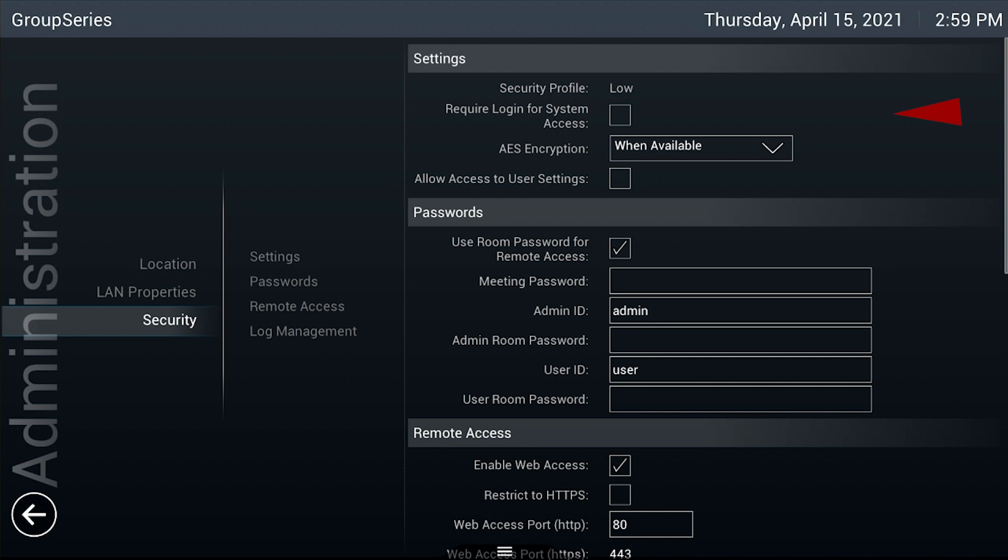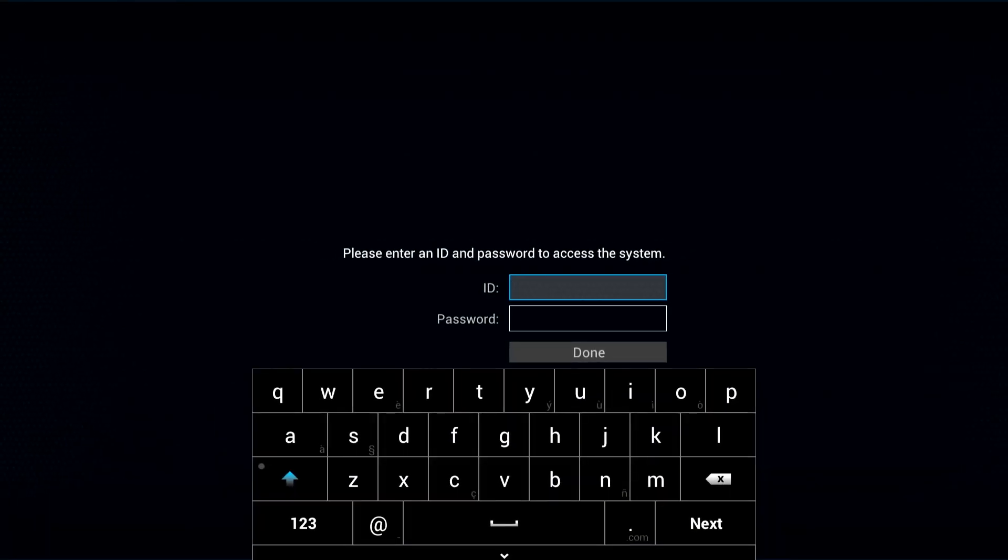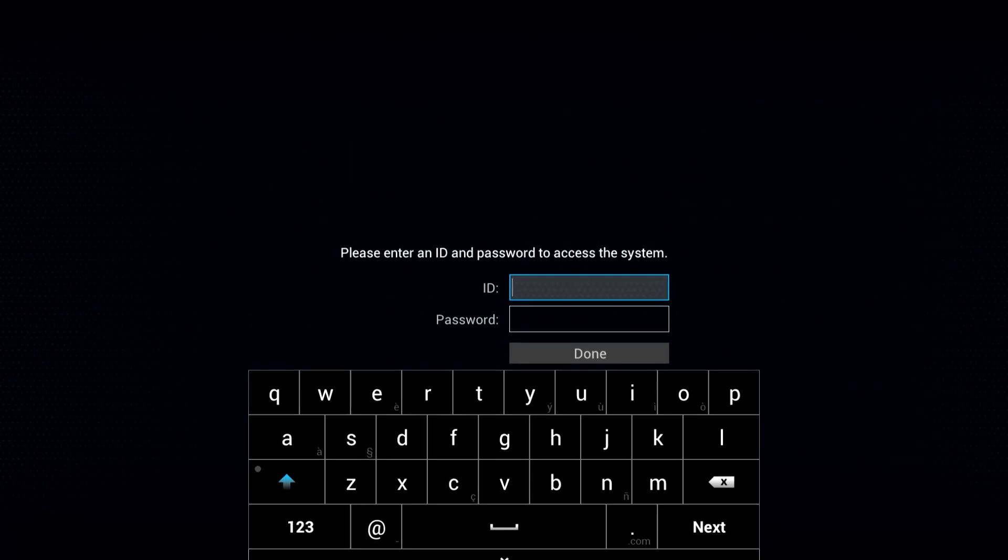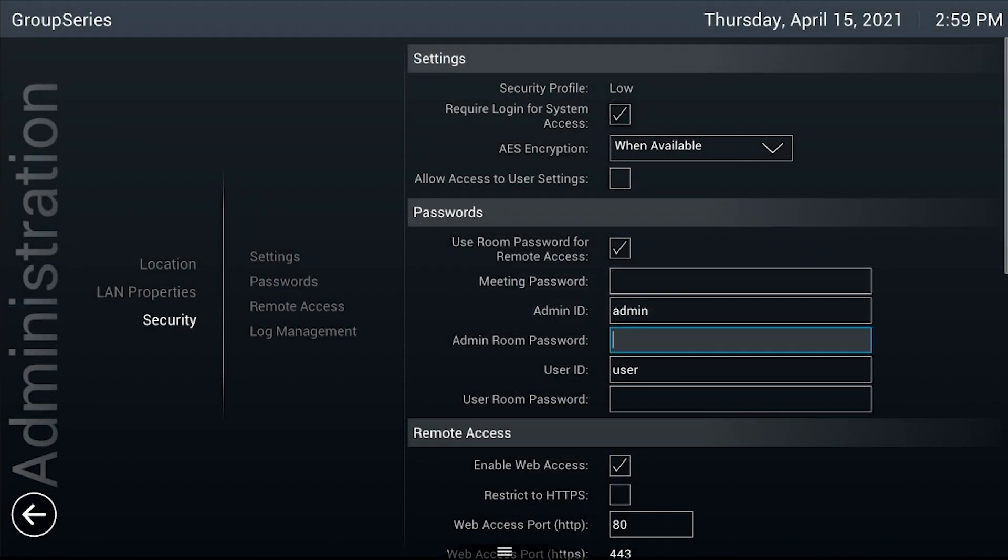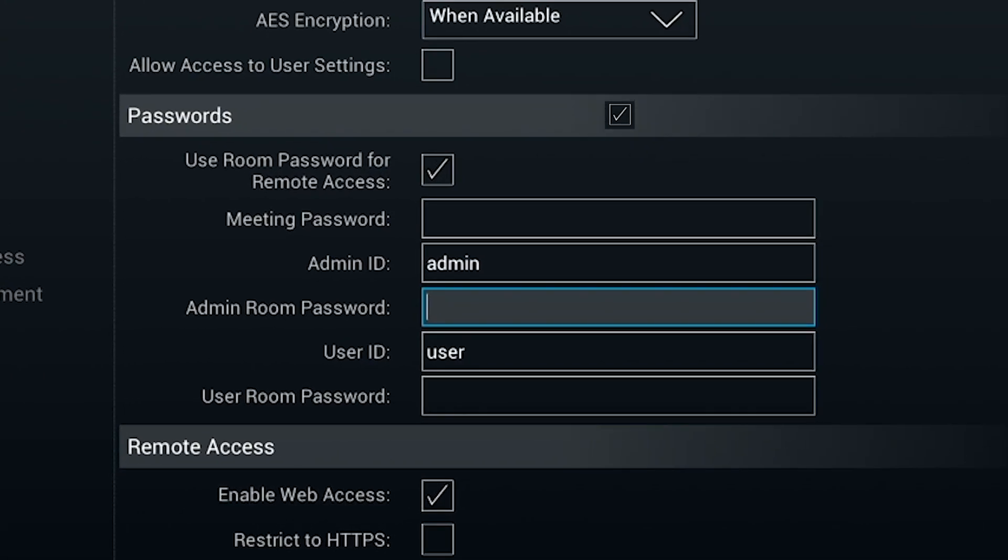Under the Settings section, check the box for Require Login for System Access. This will enable a login screen every time the teledentistry cart is powered on. On the same window, under the Passwords section, you will need to set an admin ID and admin room password by tapping on the corresponding fields. An on-screen keyboard will appear for inputting text.